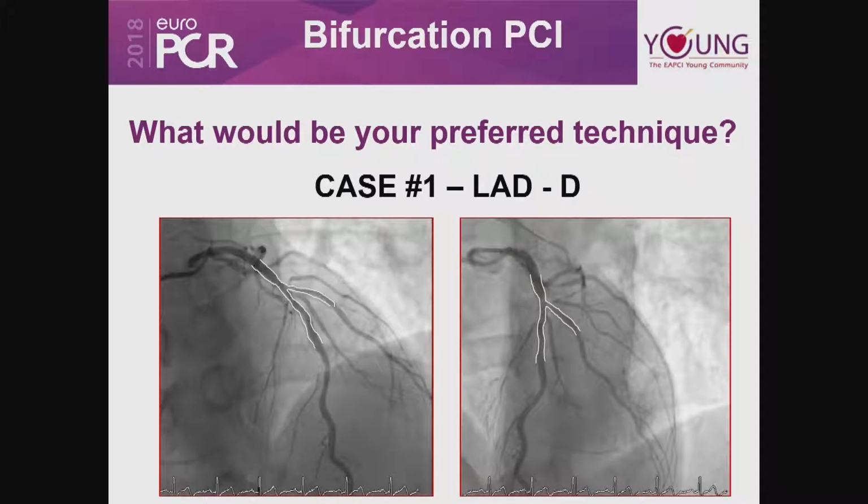Medina, this is Medina. In the left picture, I can say it's 001, and the left one is also 001 maybe. Bifurcation. Let's make a poll, because there are some discussions. So who says? Let's start point by point.